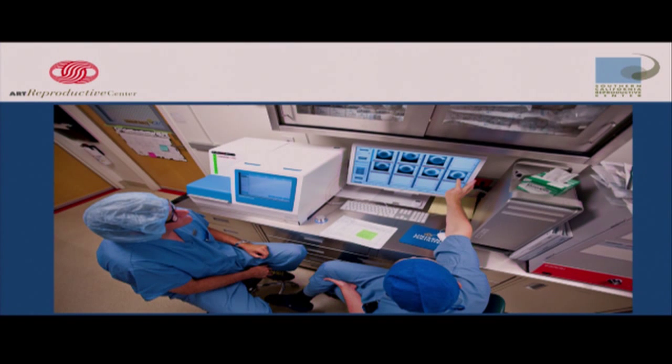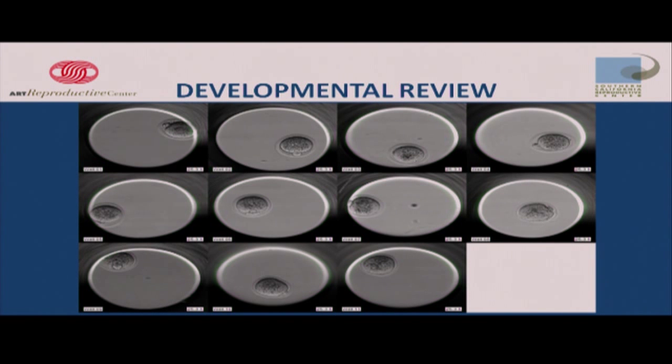So here actually is the EmbryoScope on the left-hand side, and Dr. Hill, who's my direct boss, and I'm on the right-hand side, and we're going through a set of, in that case, 7 embryos on that screen, looking at them all through their entire developmental history and trying to pick what are the top 1, then number 2, then number 3 to make the best decision for the physicians. And then we track it. We print up a picture from it, and we send it off to the physician and the patient so that they can have the appropriate discussion about what has happened. We tell them all about different reasons that we suggest one versus another. And then ultimately, if they become pregnant, we go ahead and give them a video. So we do a lot of review of every embryo's development.